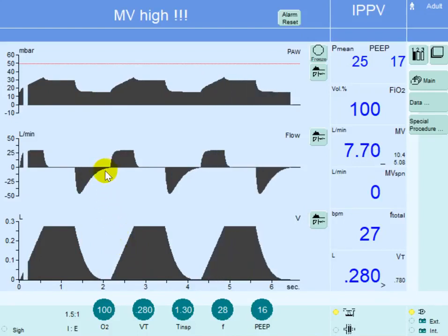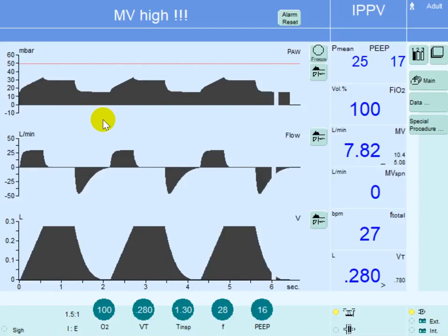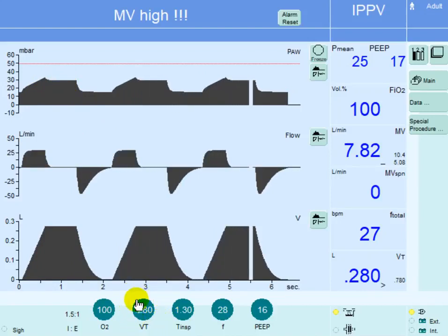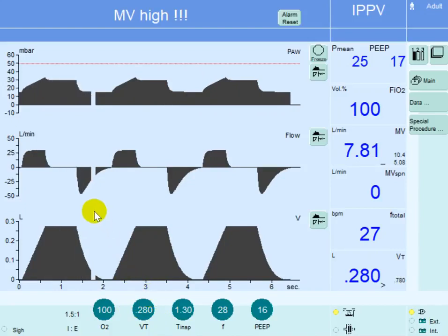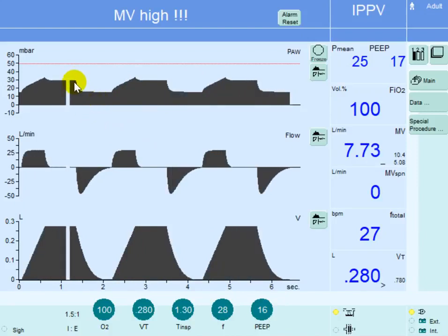The dynamic hyperinflation is eliminated and there is now adequate inspiratory time. Looking at the area under the curve for oxygenation, the protective lung strategy is fulfilled. Reviewing each element: number one, plateau pressure should be less than 30 — here it is exactly 30; number two, tidal volume should be 4 to 6 ml per kg — here it is 4 ml per kg; number three, the patient should have appropriate PEEP — we selected 16 to recruit the lungs; number four, driving pressure should be less than 15 — here it is 14.